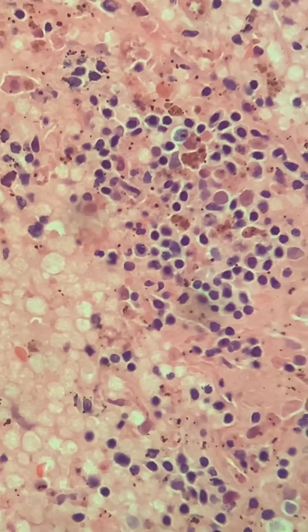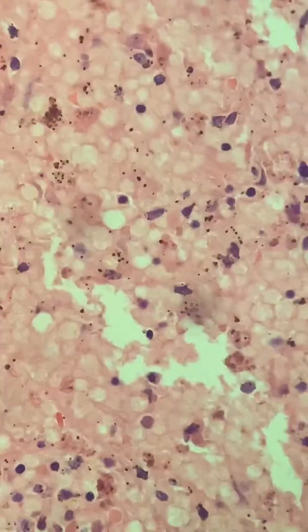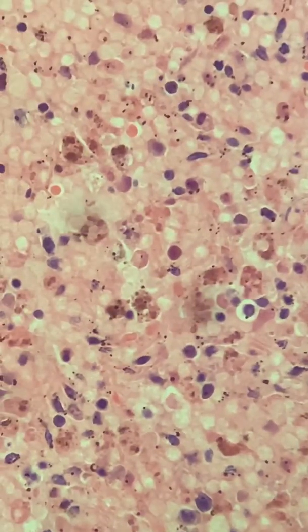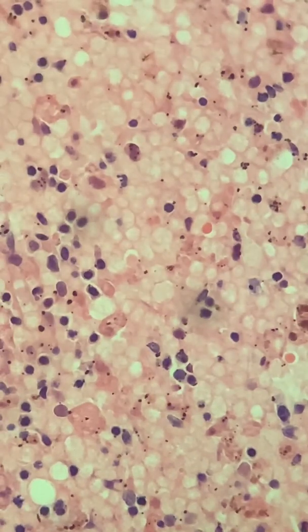There's another white pulp with lymphocytic cells, and then the red pulp being the expansion around that, with histiocytic cells, hemosiderin cells, and so forth and so on. Good lipid-laden cells there. It's a good section of the spleen. And now this is 9 days after death. So you can see that you can still tell a lot about cells even 9 days after death, as long as it's being maintained in a good frigid temperature.